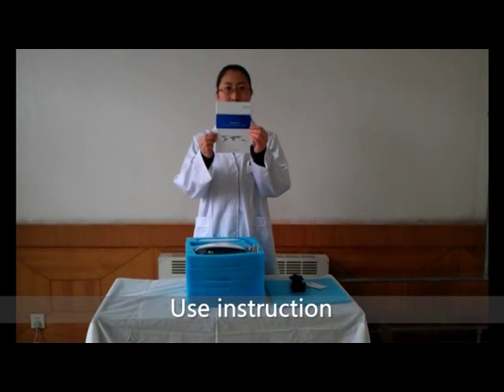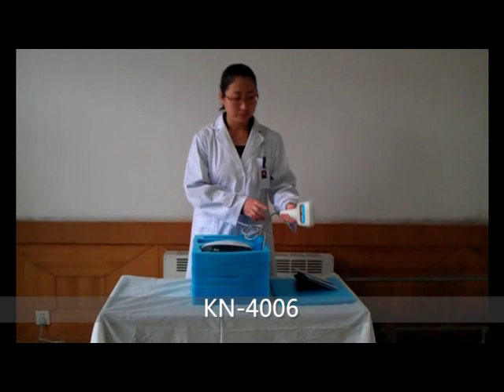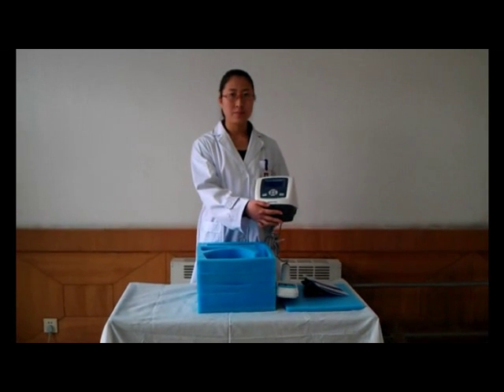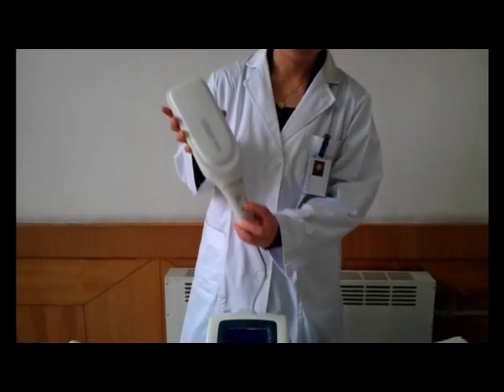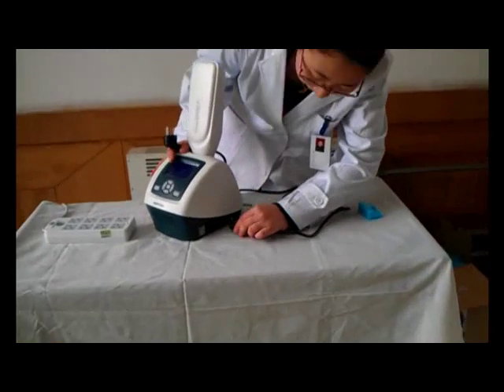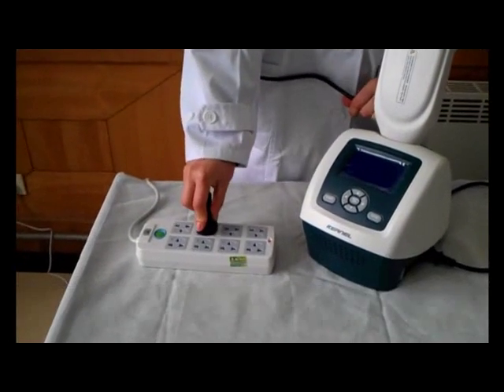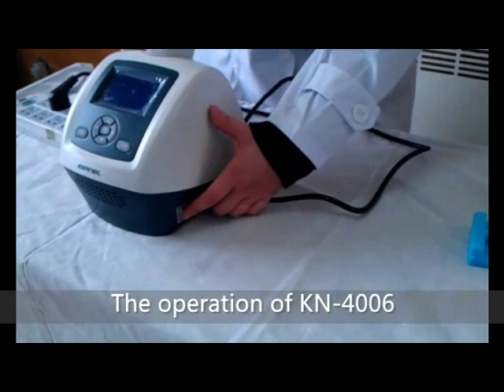Use instruction: The instrument setup begins by taking out the lamp protection foam. Hang the irradiator on the mainframe. Check that the power marked on the product label is in accordance with local power supply. Connect one end of the power cord to the power outlet on the mainframe and the other end to the socket. Open the power switch and set the irradiation time as per the use manual.